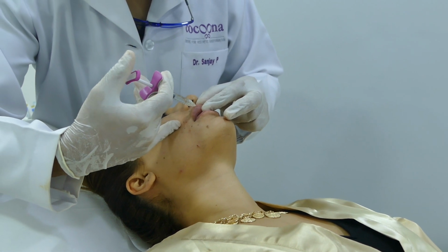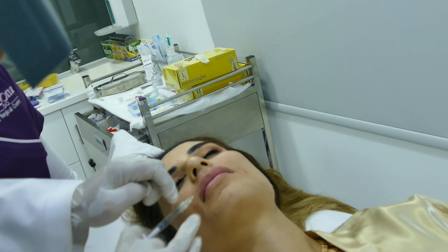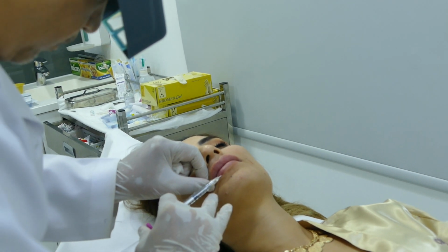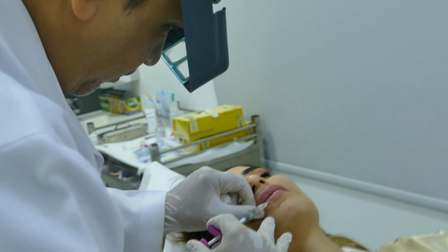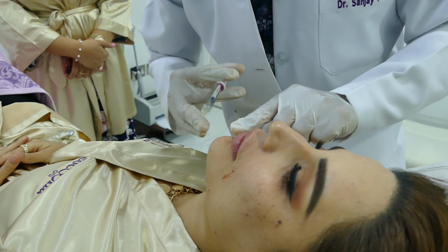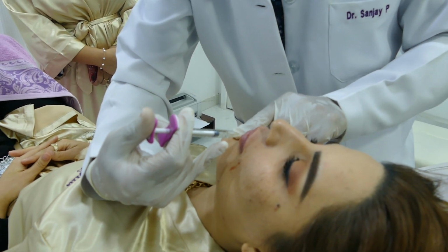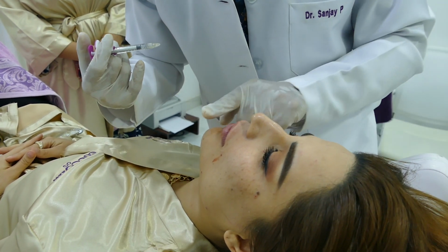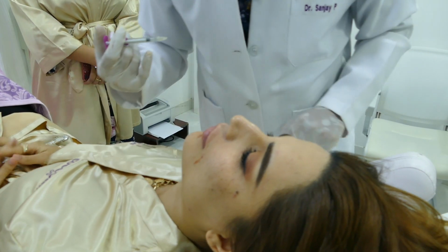This is another technique of filler injection, generally just enhancing the upper and the lower lip, for a patient who already has a good volume, she has had previous filler injections. So I'm generally injecting in the lower lip, in the central part of the lower lip, and this is more submucosal filler using a low G prime filler. The lower lip is generally forgiving, so even if it is a bit more in volume, it does not look too awkward, unlike the upper lip where an excess volume can make it look very, very prominent.